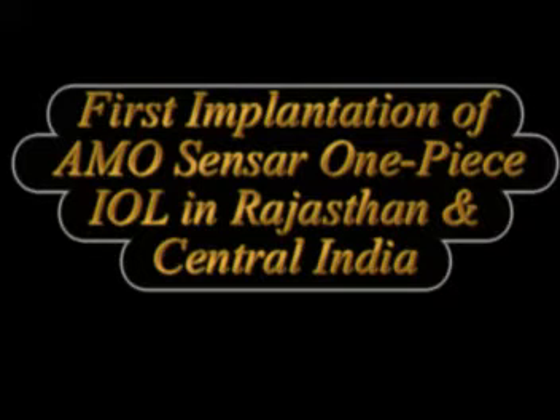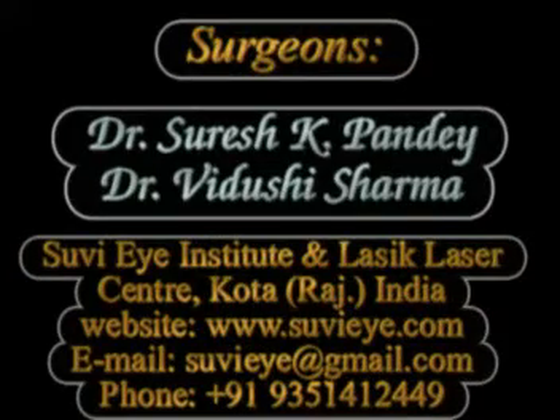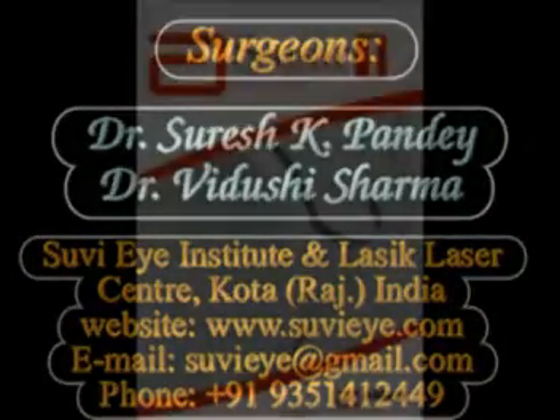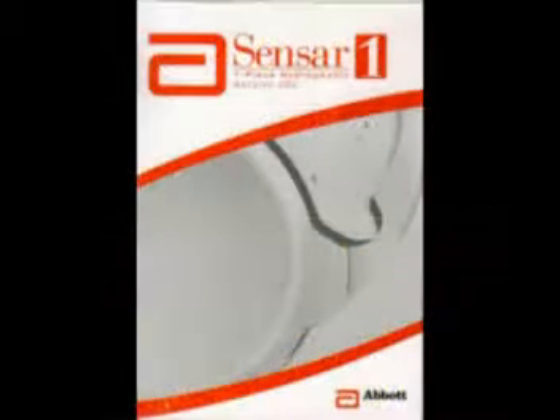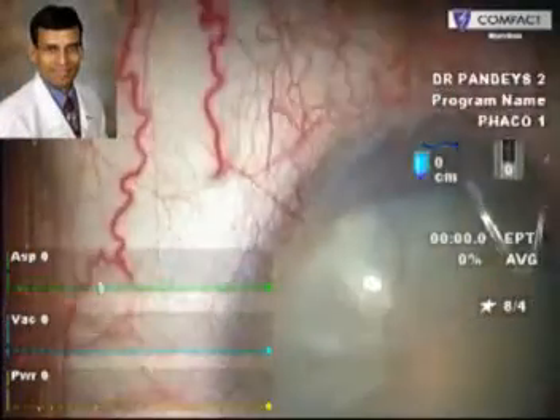Hi, I am Dr. Vidushi and in this video from Suvi Eye Hospital, Kota, Rajasthan, we show the first implantation of a SENSAR-1, that is a single-piece SENSAR-1 IOL manufactured by Abbott Medical Optics in Rajasthan. This is the case where we implanted the single-piece SENSAR-1 IOL.